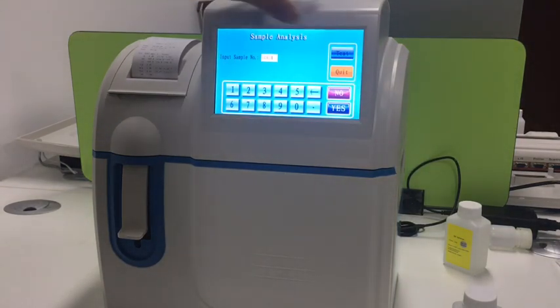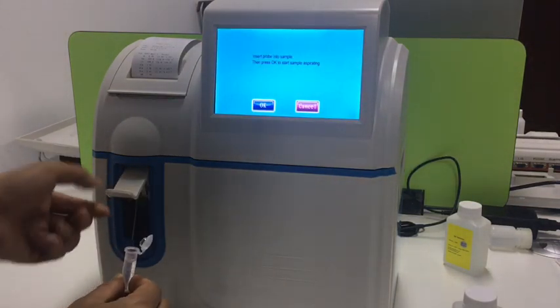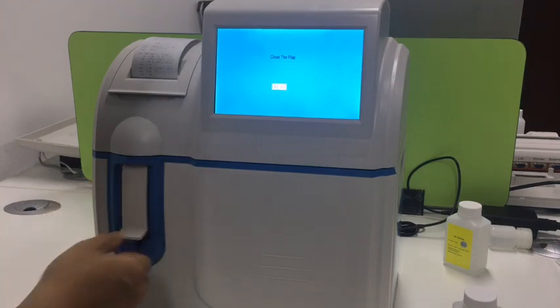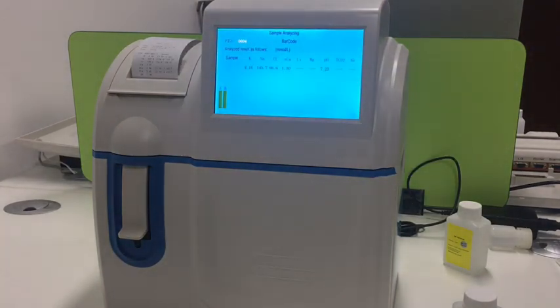Press sample analysis, then press test. Feed the sample to the sample probe when the message prompts, then close it and wait. It will show the result of the concentration for each parameter in the solution.